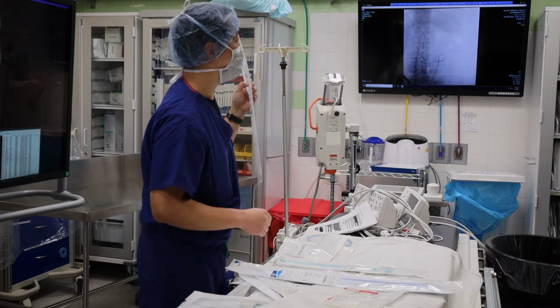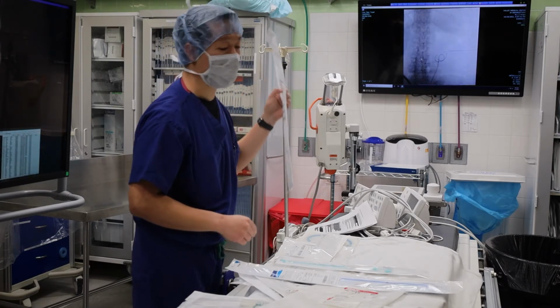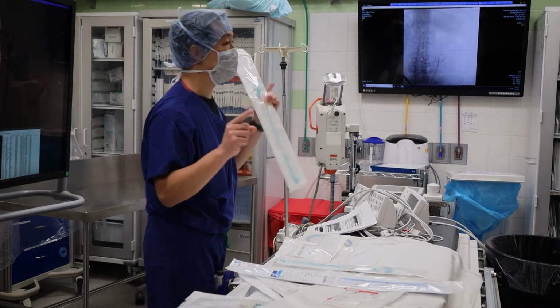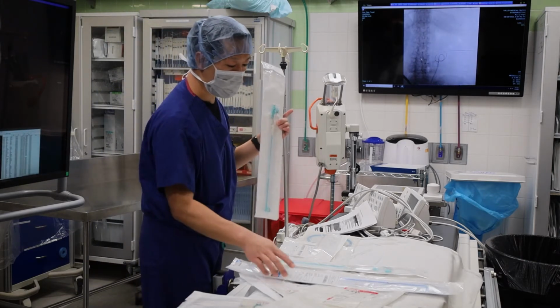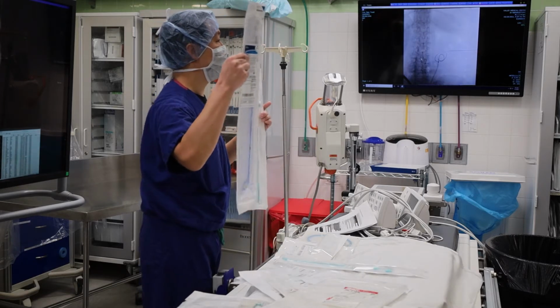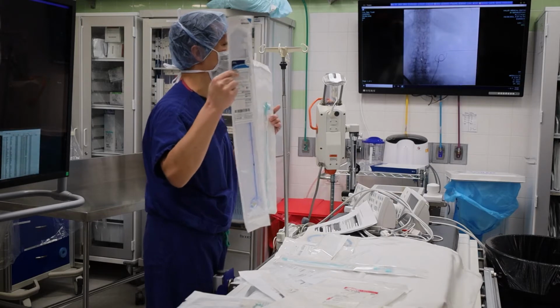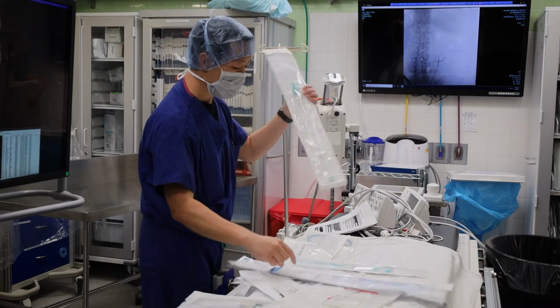Well, how long is the perc Neph? 35. 35, right? As long as I have 35 sticking out of the skin, we're good enough. If we were putting in this, a 75 Amplatz would not be long enough. Right? Now you need a 150, right? So it's all driven by this.